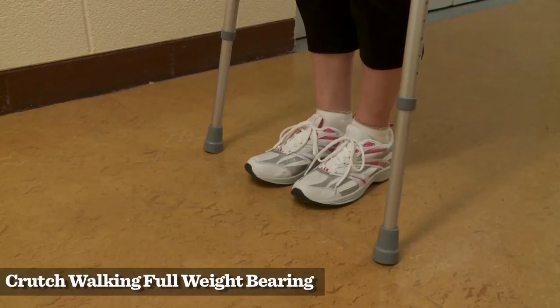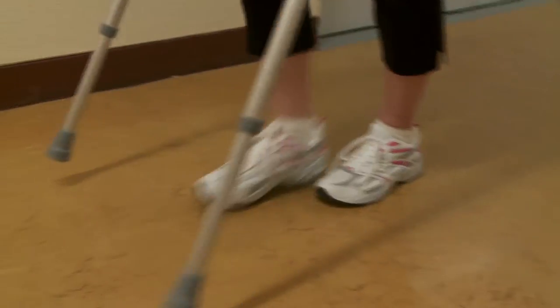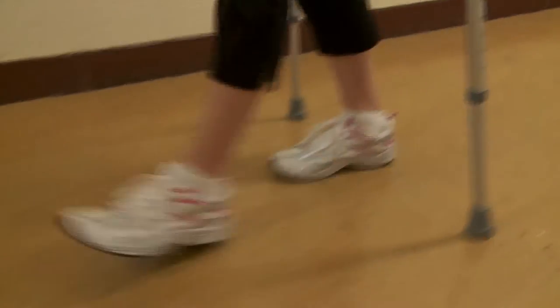Take your weight evenly on each leg. Place the crutches 15 centimetres to the side of your feet. Move the crutches forward about 30 centimetres, moving your bad leg with them.